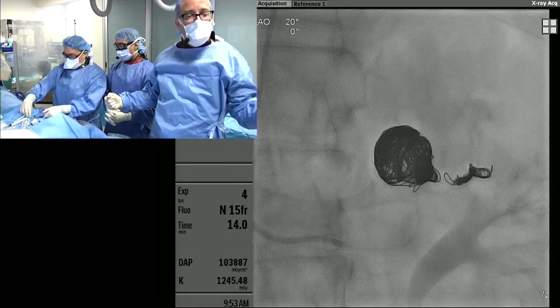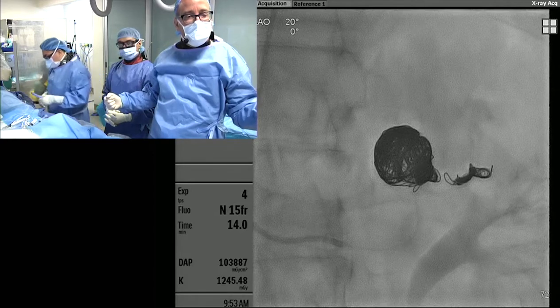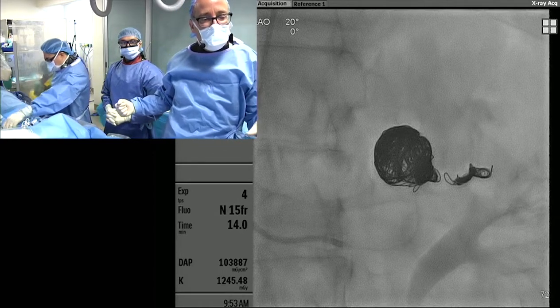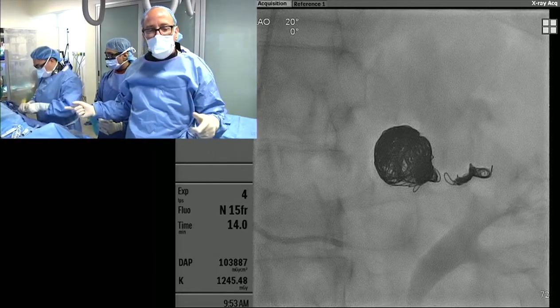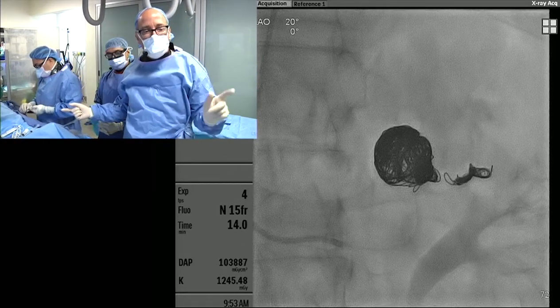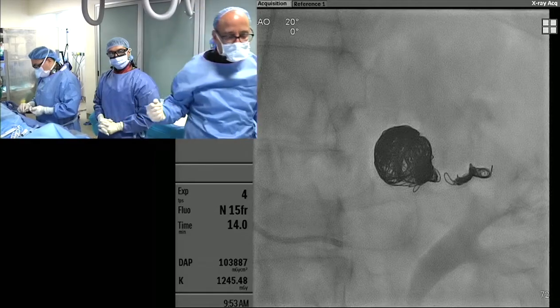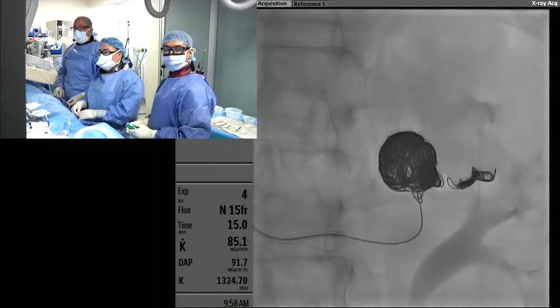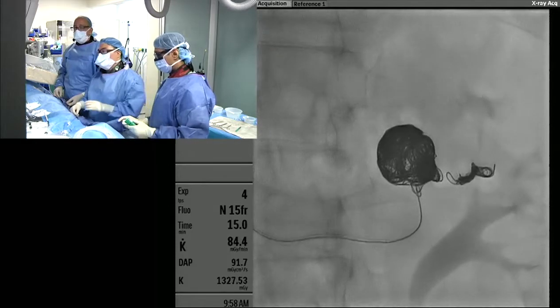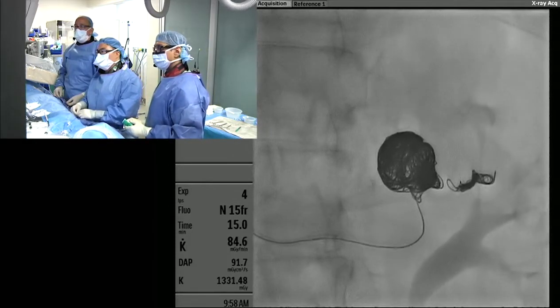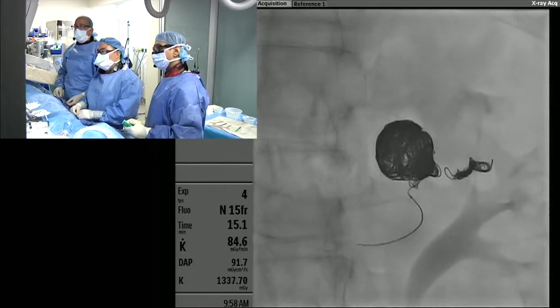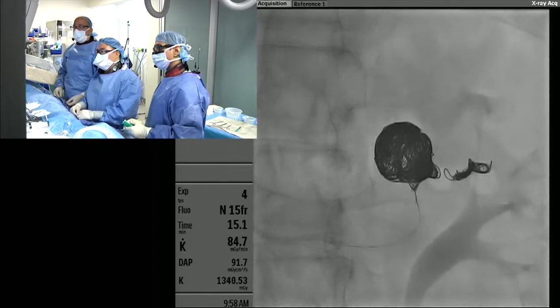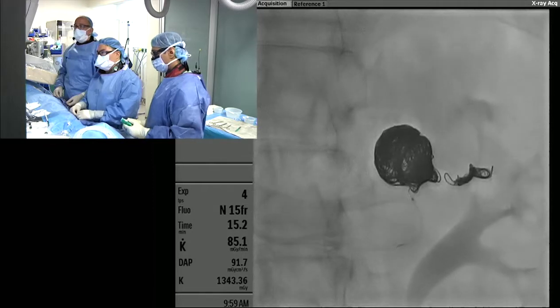We're going to switch over to a different technology to close up the inflow, then you guys can come back and we'll show you how the other coil technology works and our final run. We've switched over now — we're using the Azure CX hydrocoil and you can see we're packing the inflow.